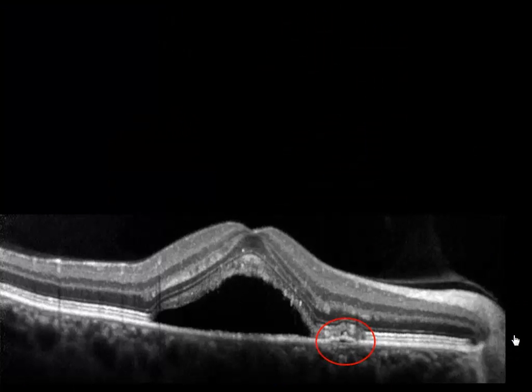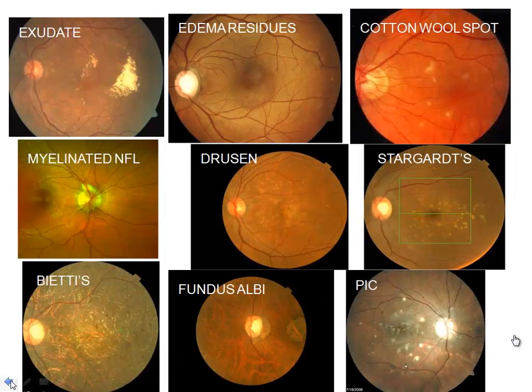Oh, let's go back one. I don't know where my blue is. We have a sense of where it is. Oh, it's all the way in that corner. Okay, let's go back just one more.